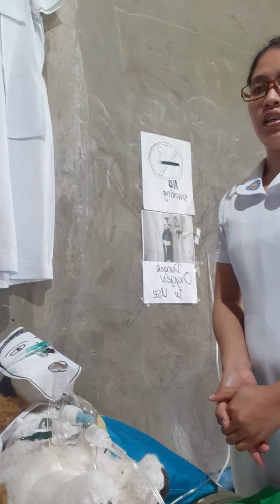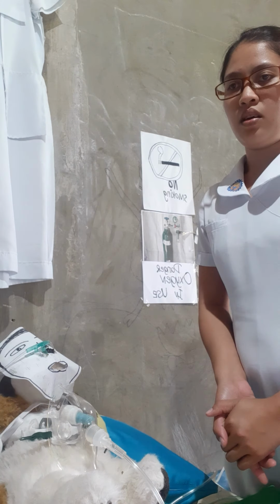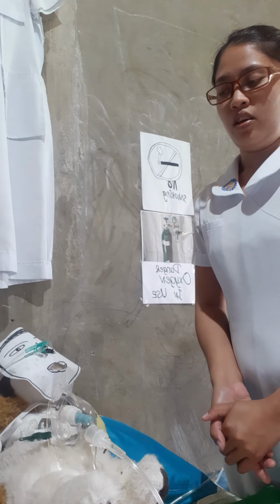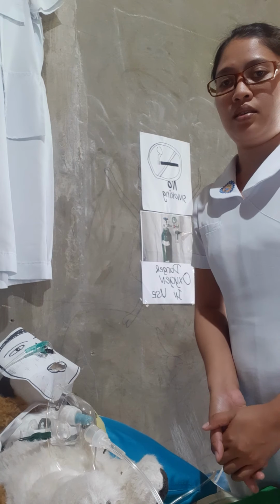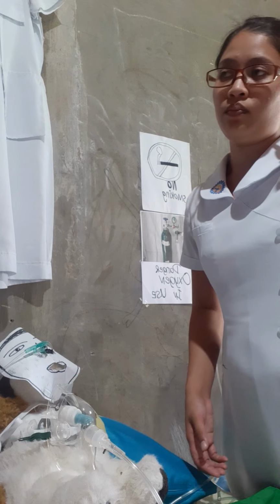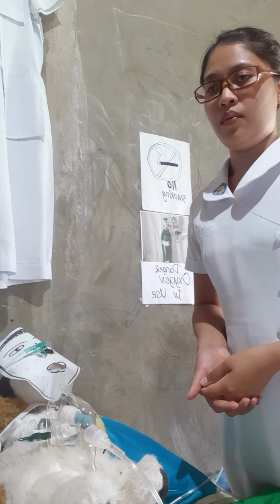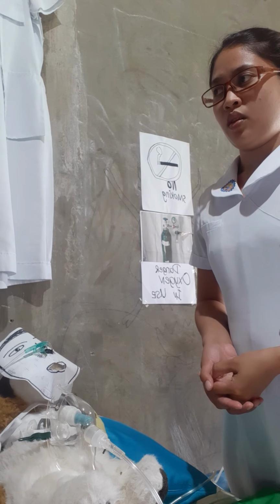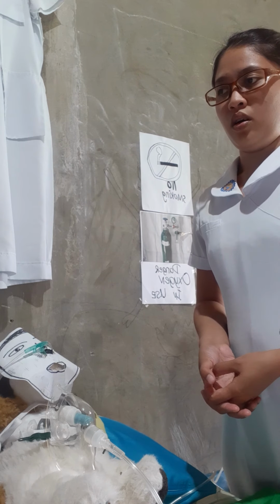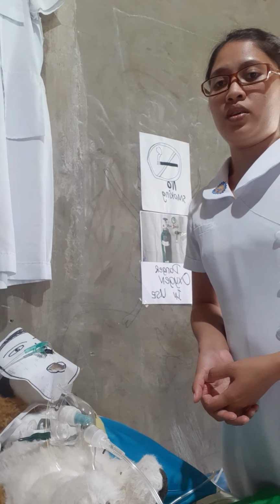Then suction the tracheostomy if necessary. But if the suction is complete or done, we only need to remove the dressing and discard. But we need to discard it prior to removing the gloves that we used for suctioning.